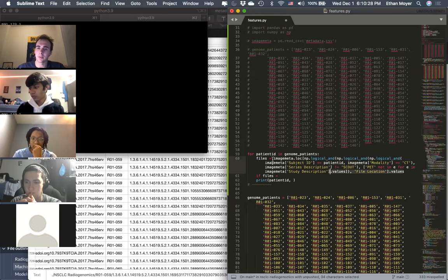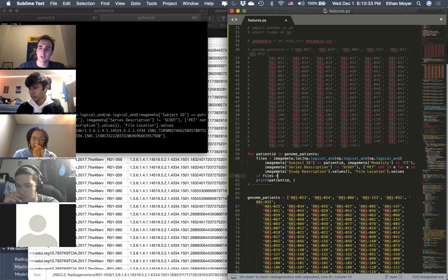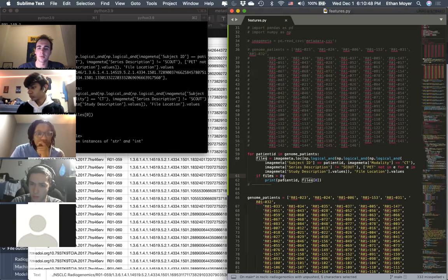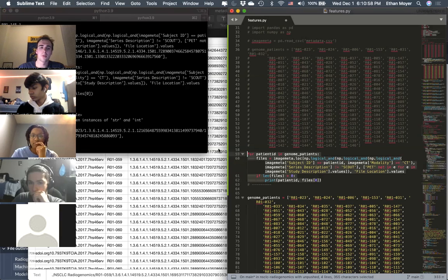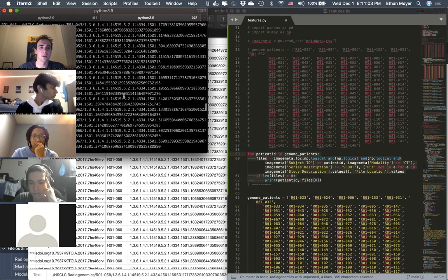Let me just test this one out real quick. It's going to be a list. So if it's equal to 0 or greater than 0, we're going to print out this plus files there. And what that allows us to do is just grab the first one. There we go. So these are all the files we're using.